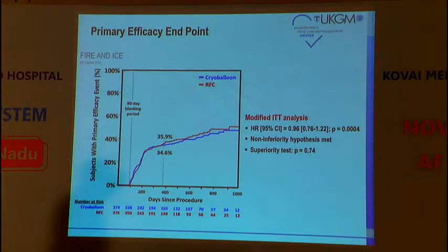Okay. That's interesting. There's no difference from the gold standard radiofrequency ablation. At that time, you just have to think there have been millions of ablations with radiofrequency and not that many ablations with cryoballoon. So there's no difference. Both are equal. And this study was never powered for superiority, only for non-inferiority. So if this study had been powered in a different way, the results might have been different.